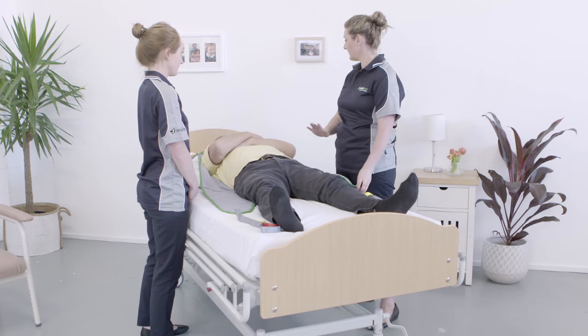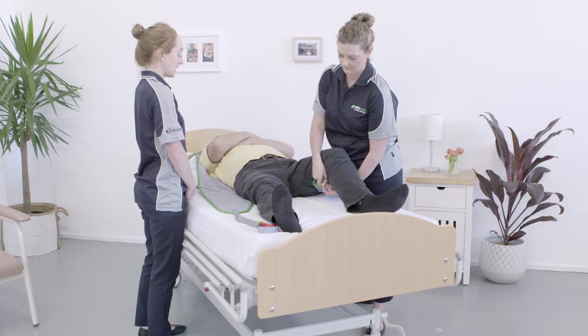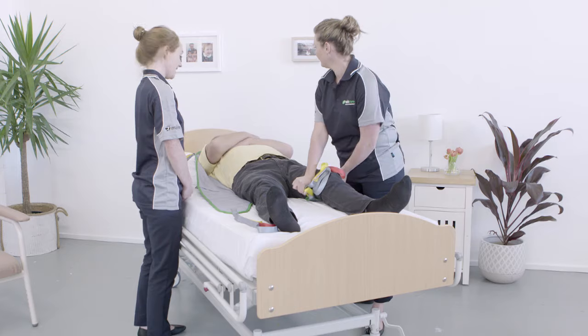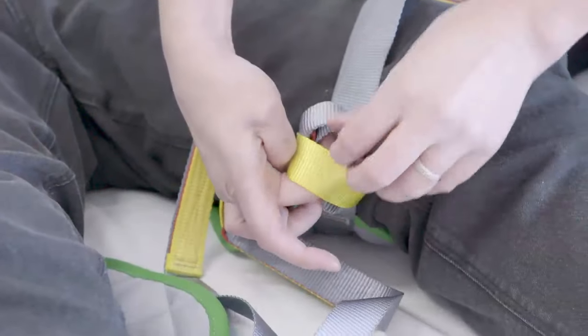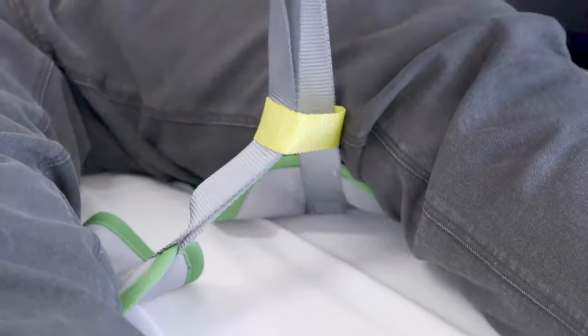Ask the resident to slightly bend their leg or assist them to do so. Then, one at a time, bring each leg strap so that it is smooth under their thigh. Notice how Aspire slings have a yellow central loop — this can be used for additional dignity and comfort during the lift.